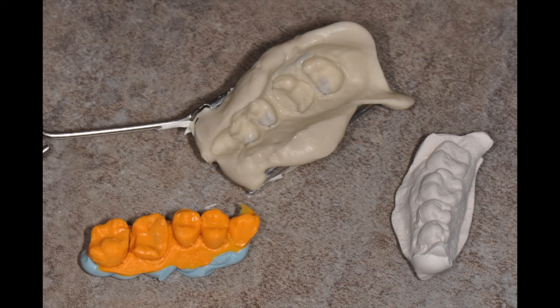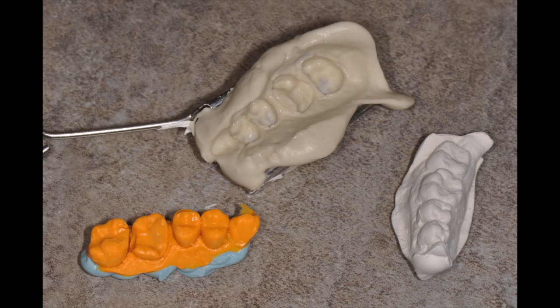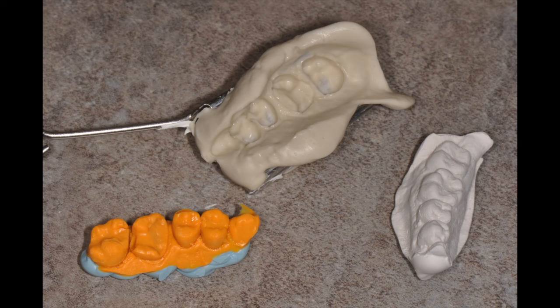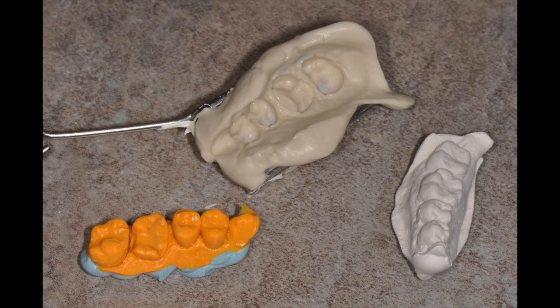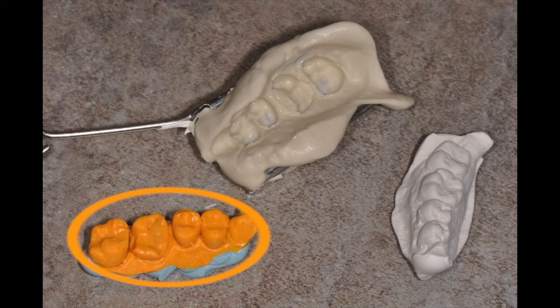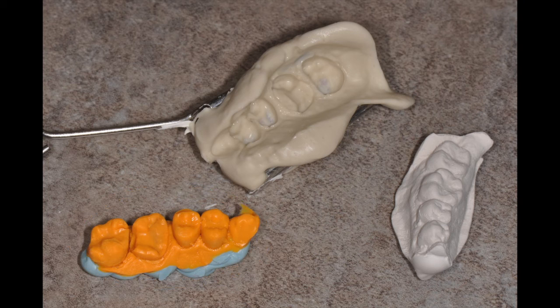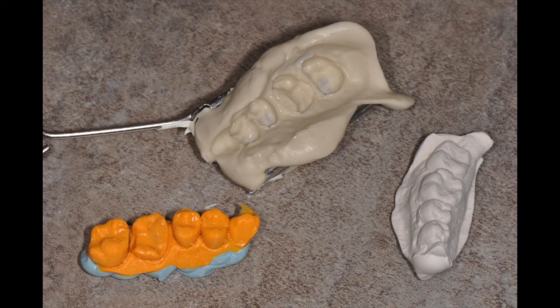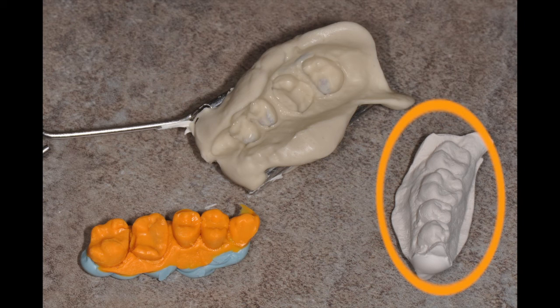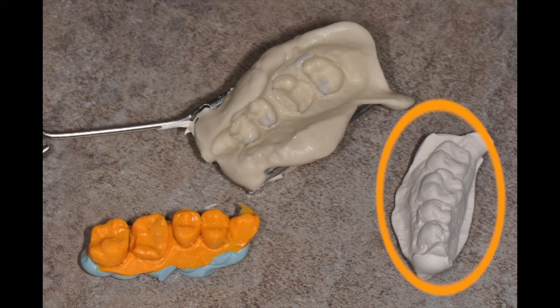Once the prep is completed and sealed, the rubber dam is removed and an alginate impression is made with the triple tray. To record accurate margins, a Monoject syringe was used to deliver alginate around the preparation margins. The preparation side of the impression is immediately poured to prevent distortion using a light body polyvinyl siloxane impression material, creating an accurate, flexible, and workable model. The opposing side of the triple tray is poured with a quick-set stone to establish the occlusion for the composite onlay outside of the mouth.